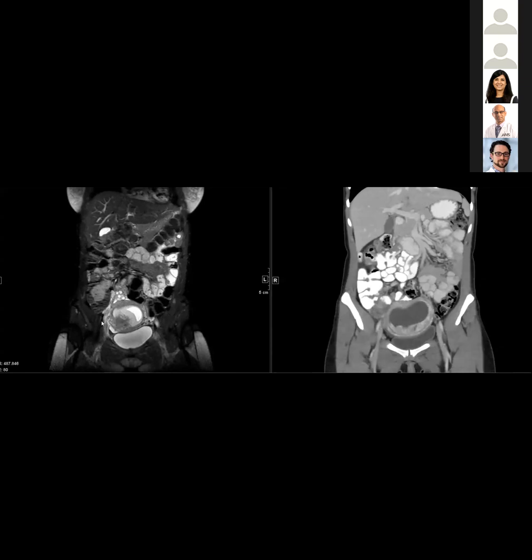Victoria, this is Manjul. I mean, perhaps the ovary's torsed, and that's why there's no drainage into the gonadal vein, or it's slow filling, or perhaps it's mixing slower than it would otherwise. Right, that's what I'm saying.